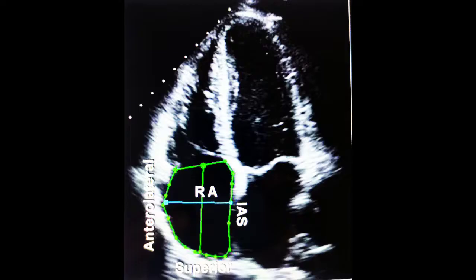Right atrial dilatation is estimated from the four-chamber view. The upper limit for the major axis dimension of the RA is 53 mm and the minor axis is 44 mm. If the RA area is more than 18 cm² at end-ventricular systole, that is considered RA dilatation — one of the signs of pulmonary arterial hypertension.